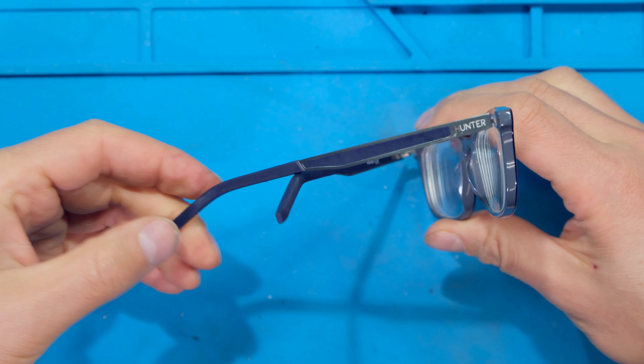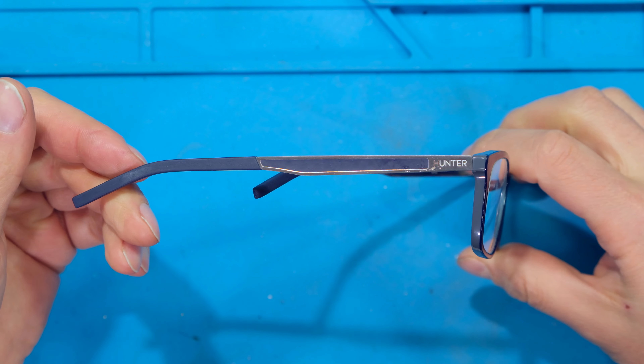Hi, in this video I'm going to demonstrate how to form the temples on a pair of glasses.